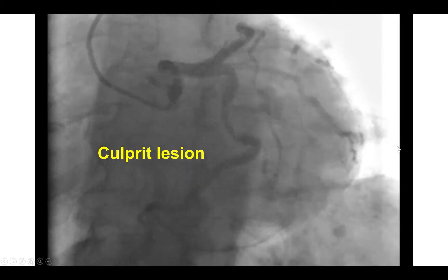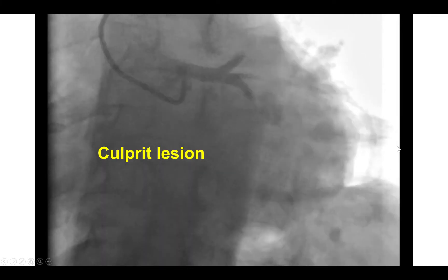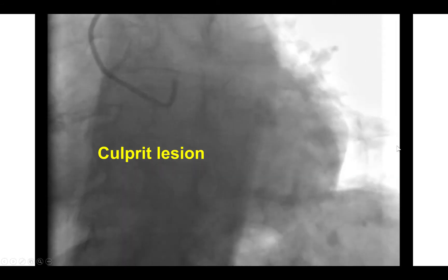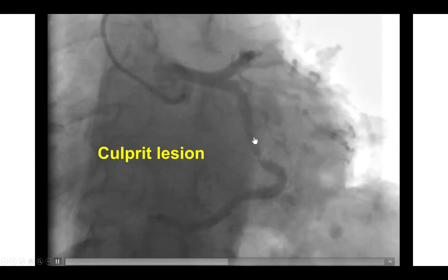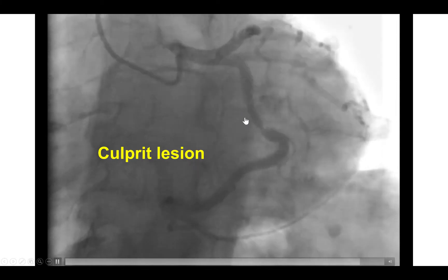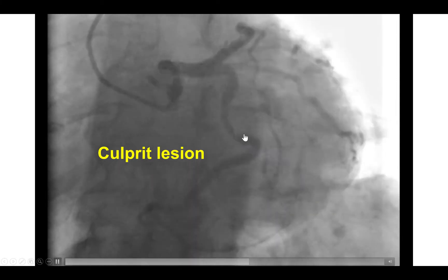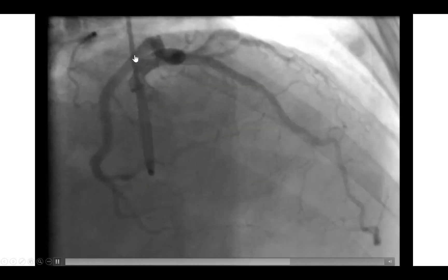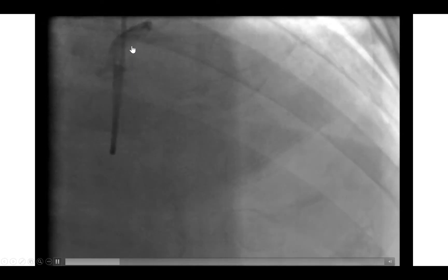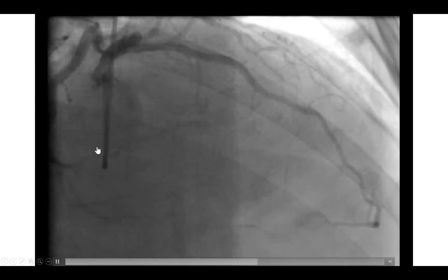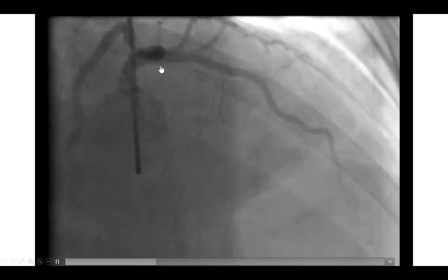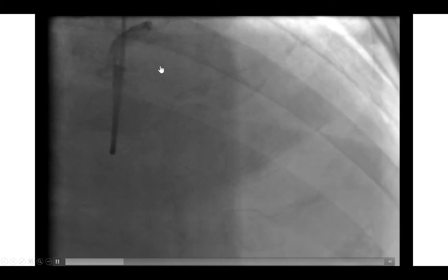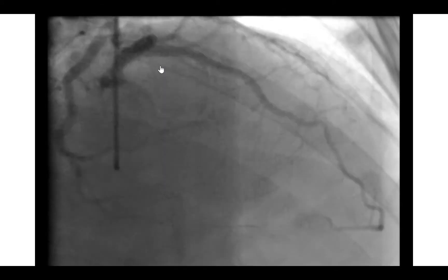We returned back to the left coronary artery and performed repeat injections, this time in additional projections. In the spider view, we do see a significant ulcerated hazy lesion in the proximal circumflex, which was also seen in an apicranial view. There was the culprit, and that makes sense because the patient does have a left dominant system, something that is sometimes easy to dismiss during the urgency to recanalize in primary PCI.